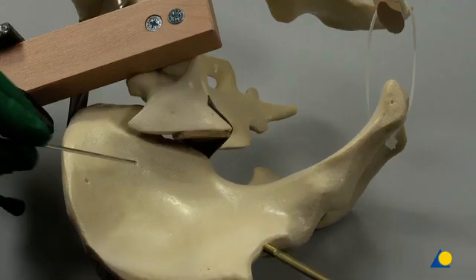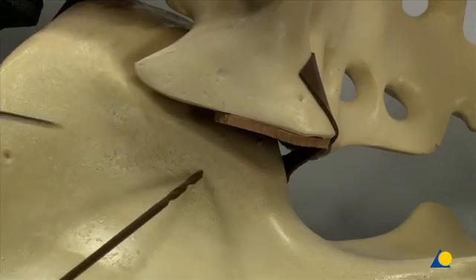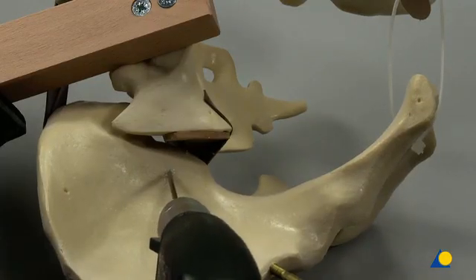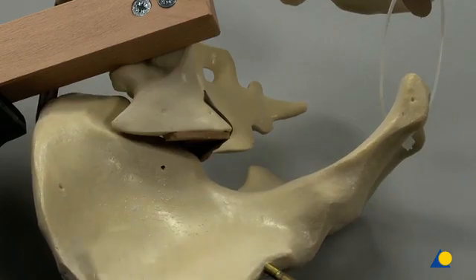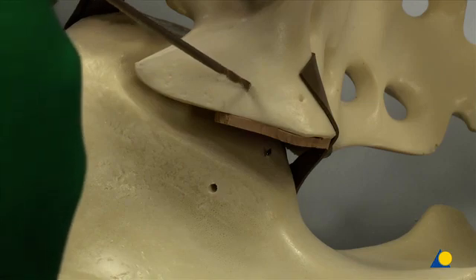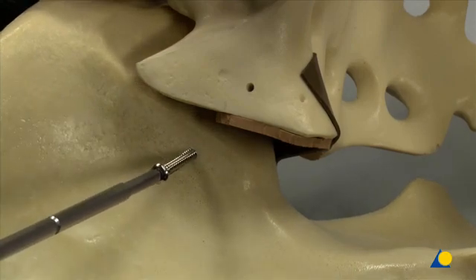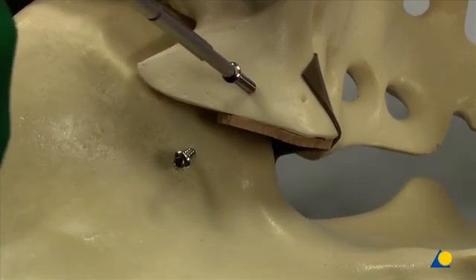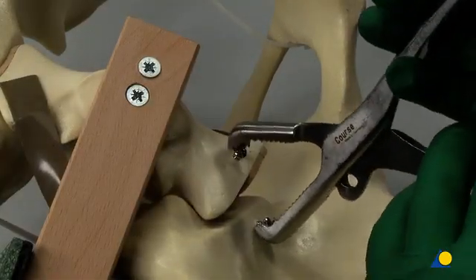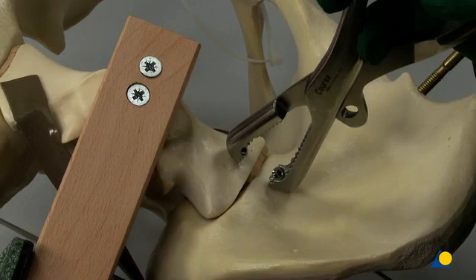Define the spatial orientation of the sacroiliac joint with the aid of a K-wire positioned inside the joint. Parallel to this K-wire, drill a 2.5 mm hole into the iliac bone close to the sacroiliac joint. Drill a 2.5 mm hole in the lateral part of the sacral ala. Insert two 3.5 mm cortex screws of appropriate length. Place the Faraburf clamp around the screw heads.